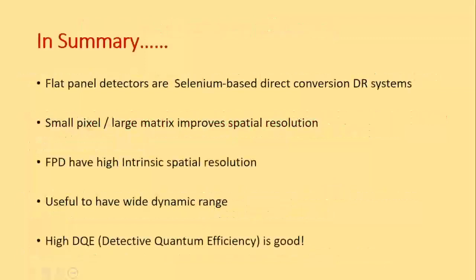Yes, so that's done, I guess. So just in summary of what I discussed in the last, I should say 10, 15 minutes or more, I'm not sure, is selenium-based direct conversion DR systems.